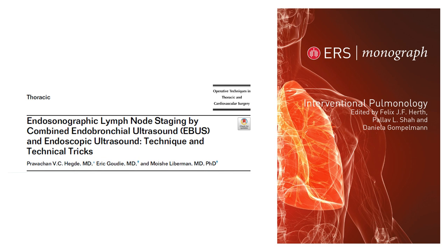Try giving antibiotic prophylaxis in that population only, based on the case series. And if and when you use insufflation, use CO2. The risk of pneumomediastinum, if there is a microperforation, is low with CO2 and it's better absorbed rather than insufflating with air. Those are some of the things that I would keep in mind for a beginner who is starting to do this.